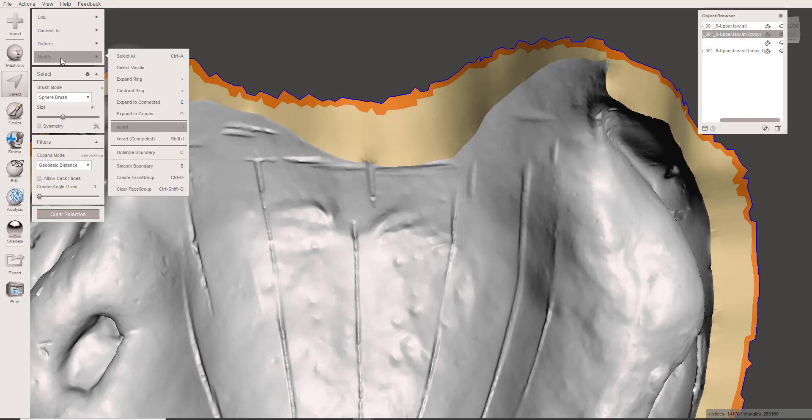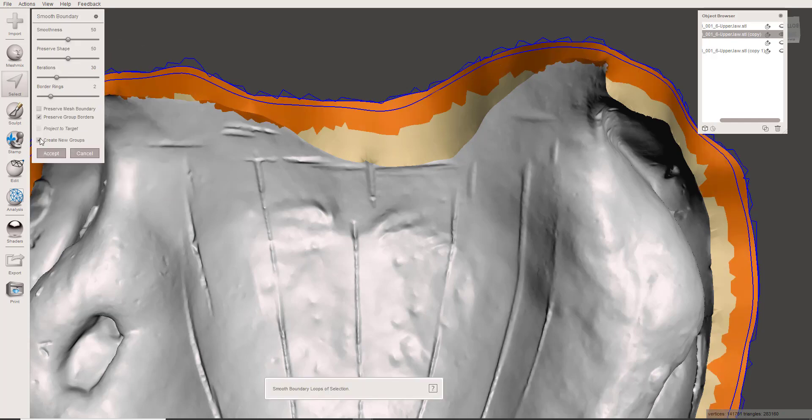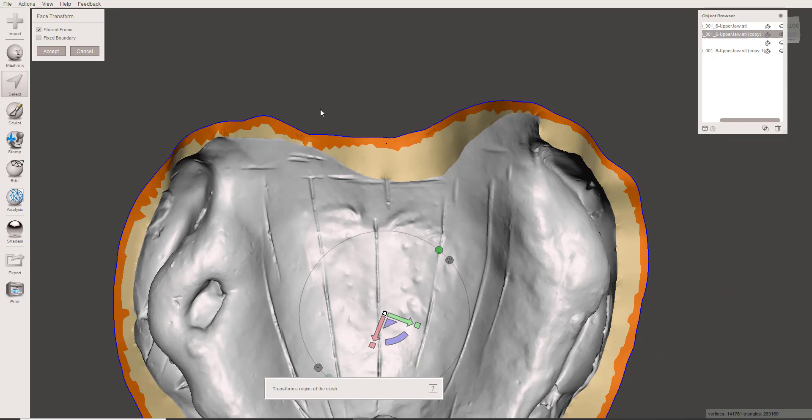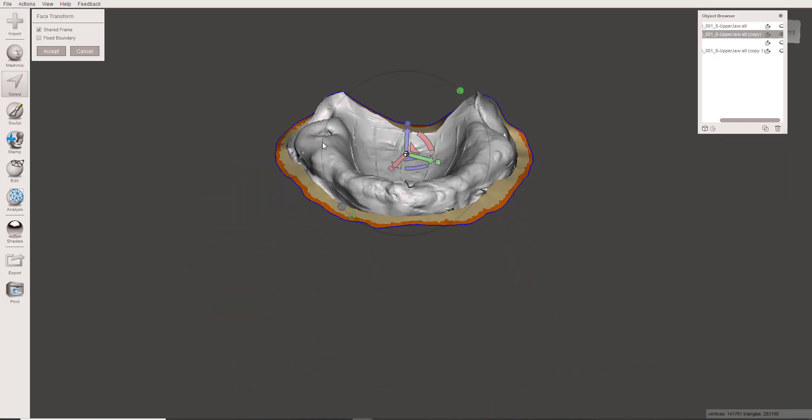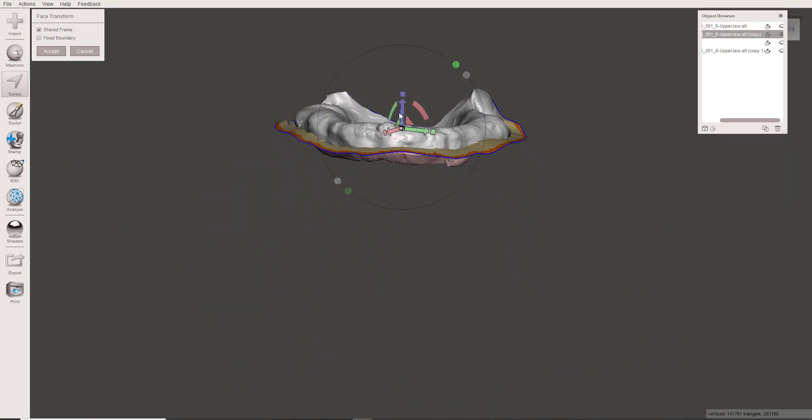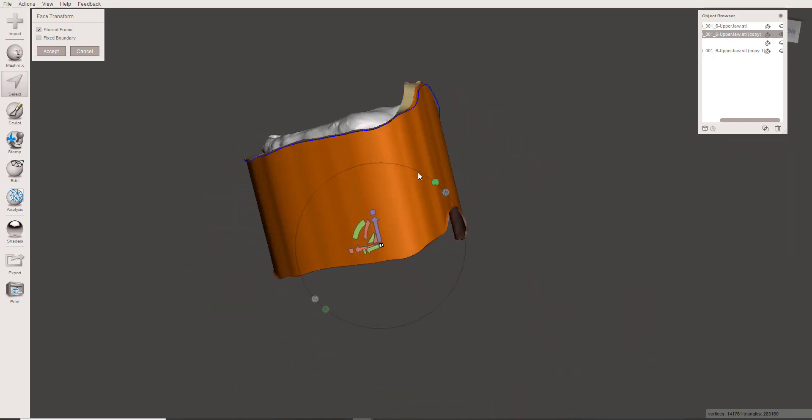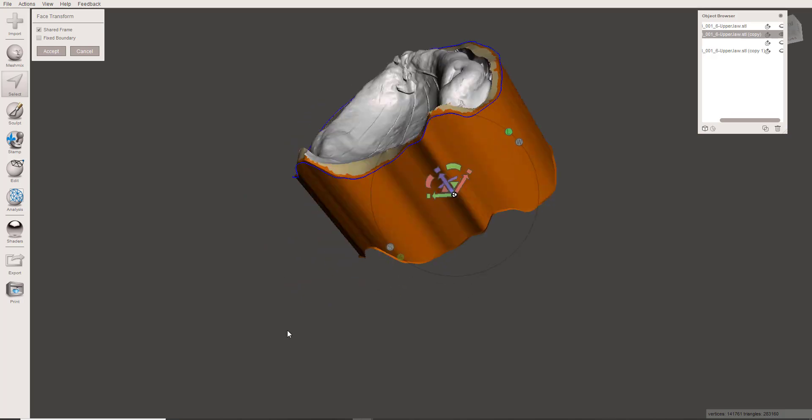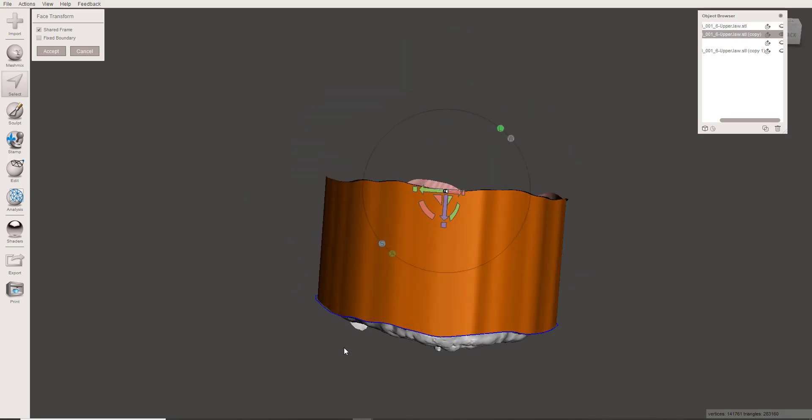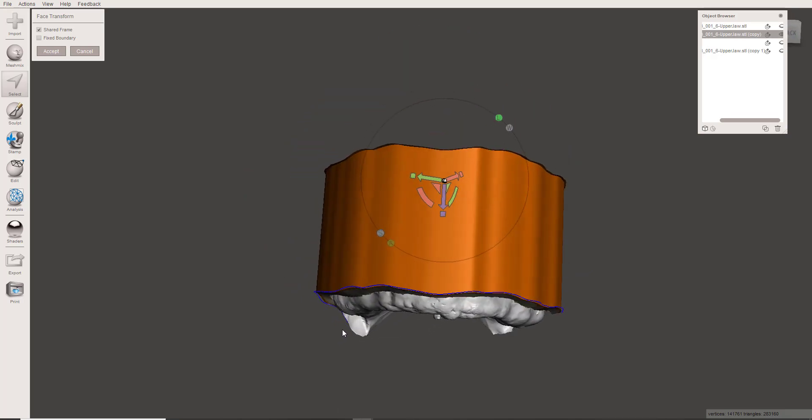Select the boundary, smooth the boundary, and then T for Transform, and let's just extrude this upward. So now you can see how nice of a base that results in.